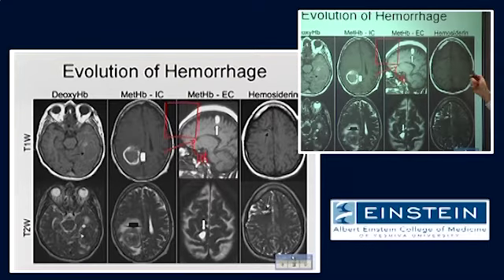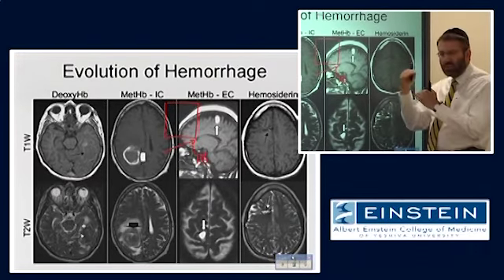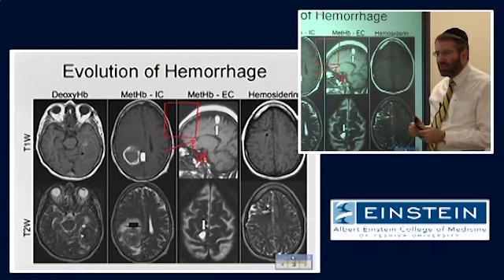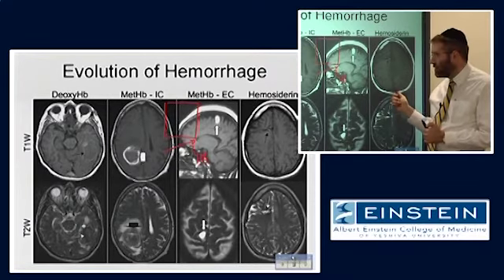Okay. This high signal in the case of hemosiderin is actually due to the fact that it is so strongly paramagnetic that it causes some distortion and movement of signal to places in the image where it doesn't belong. It's not due to a proton-electron dipole interaction.